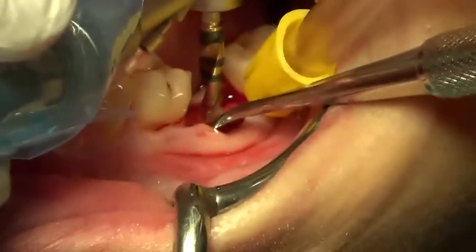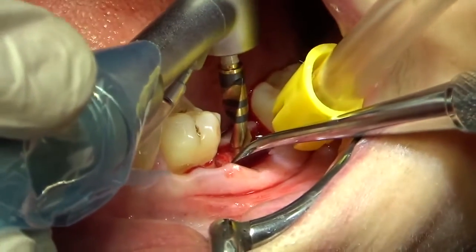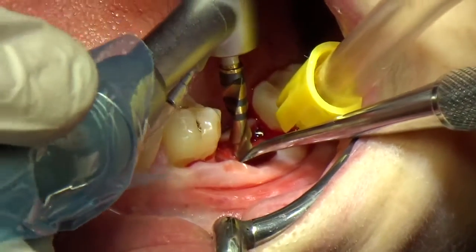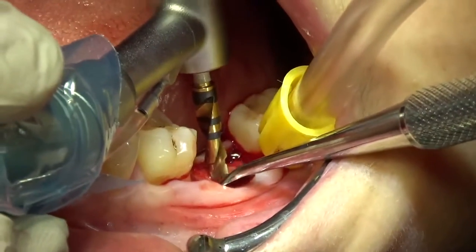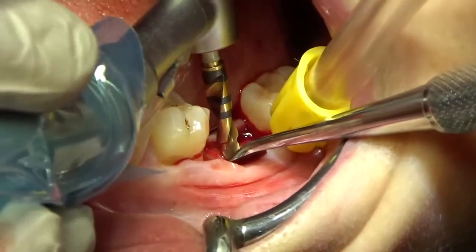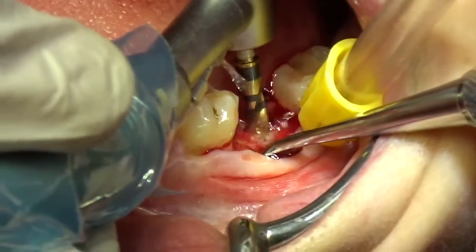Now, since we're not doing things fully guided today, I still have to watch my drill, see where I'm going. So what I'm doing is I'm watching my angulation both buccolingually, and I'm watching my angulation mesiodistally. It's going to want to fall right into our osteotomy, but still I can push it one direction or another. Where is it going to want to go? It's going to want to go buccal because there's no bone there. So we'll just very slowly and carefully start going down.